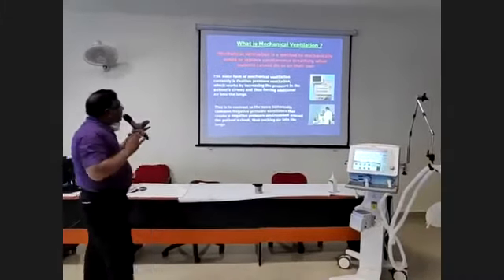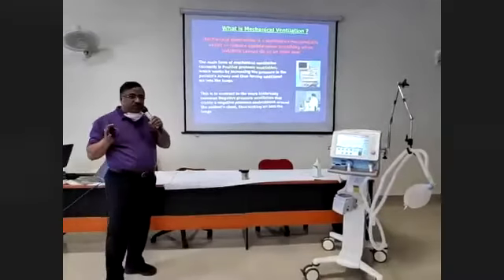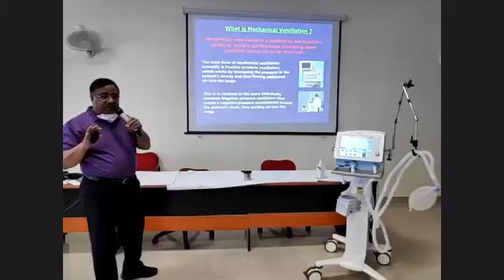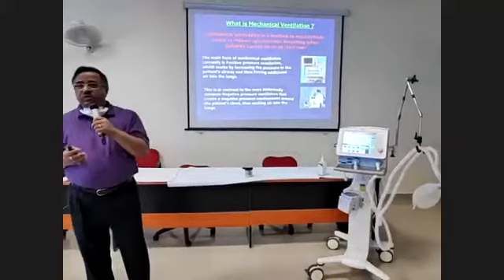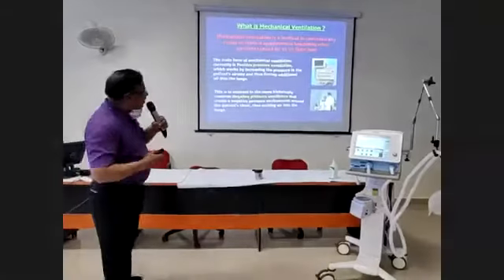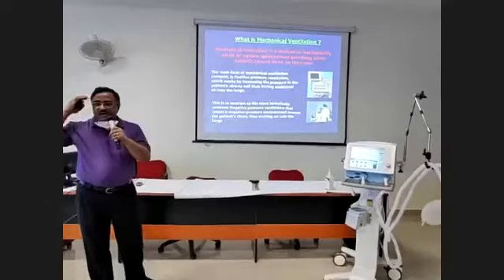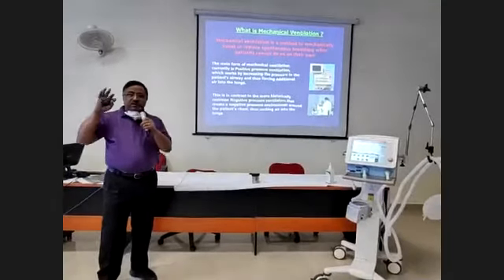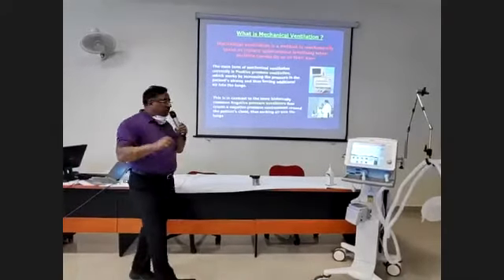So, mechanical ventilation is a method to mechanically assist or replace spontaneous breathing. The patient may or may not be breathing at that point of time. The patient cannot do so on their own, meaning the patient is not capable of doing so on his own. So you are trying to give an artificial breath with a machine, and that machine doesn't have a brain, it does not have a mind, it cannot think. The thinking is provided by you, by the settings which you do on the ventilator.